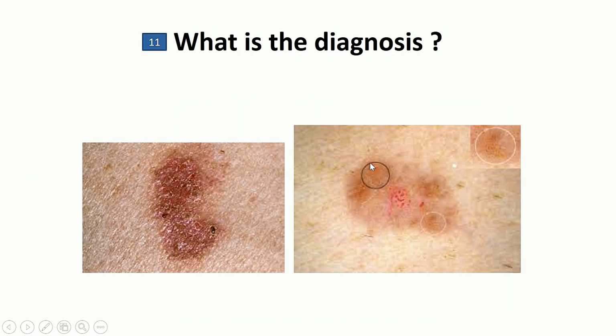There is both brown color and vascular pattern here, indicative of a keratinization and also vascular pattern here. This vascular pattern looks like glomerular pattern. These findings are indicative of Bowen disease. Both keratinization here and glomerular pattern here.